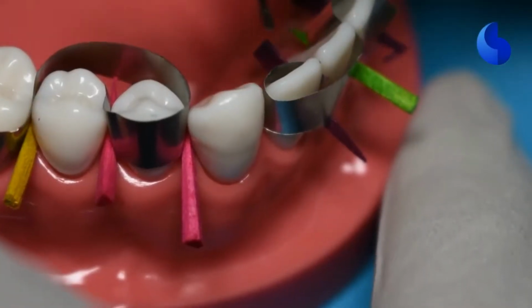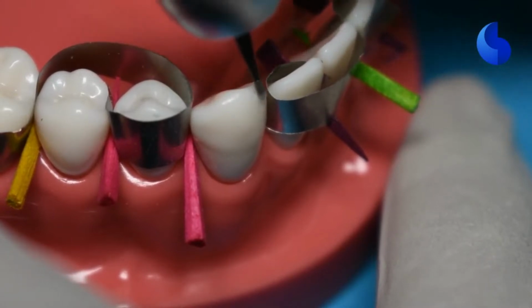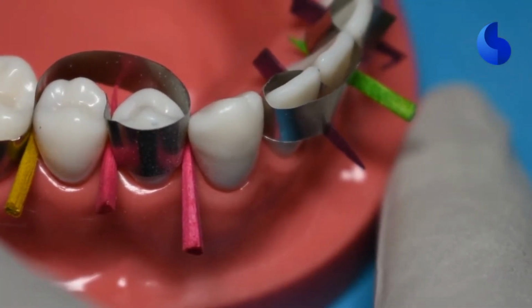In this video, we'll look at all ceramic crown preparation on tooth number 27, the mandibular canine. So it's an anterior all ceramic crown preparation. We're going to start with the incisal reduction. An incisal reduction should ideally provide you with 1.5 to 2 millimeters of clearance.